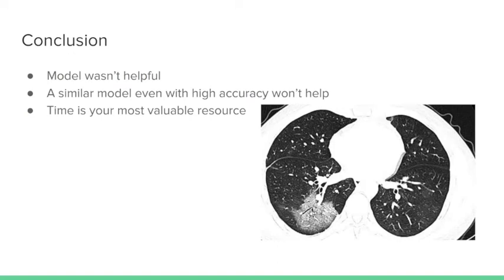Through our many experiments, we were not able to develop a model that was significantly better than the baseline of 54%. You could assume from this that the CT scans have no notable features. However, while that may be true, our dataset consisted of a relatively small number of samples with only 742 images. Had there been more images to draw from, the model might have performed better.